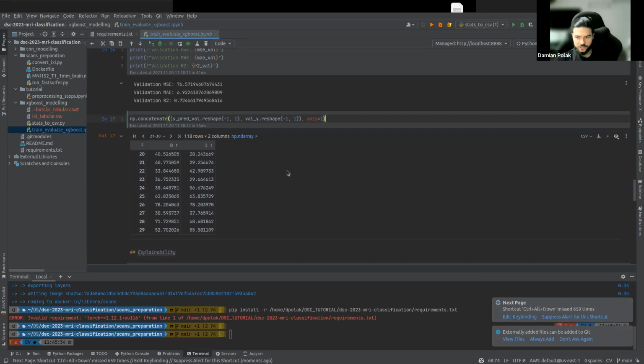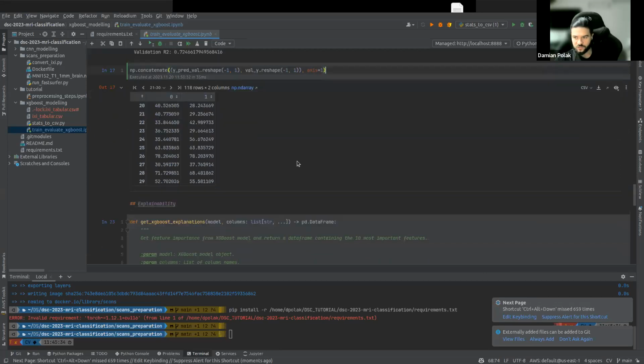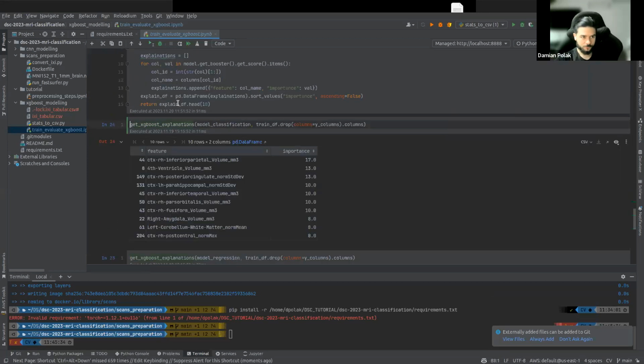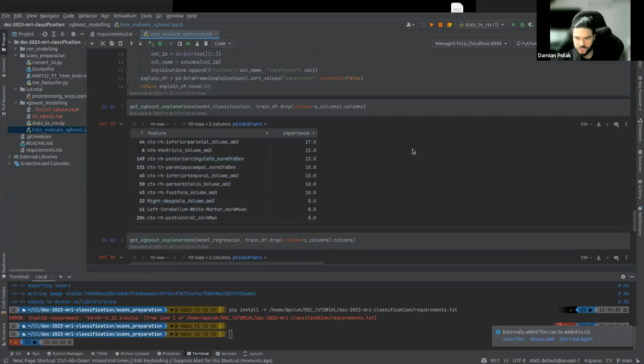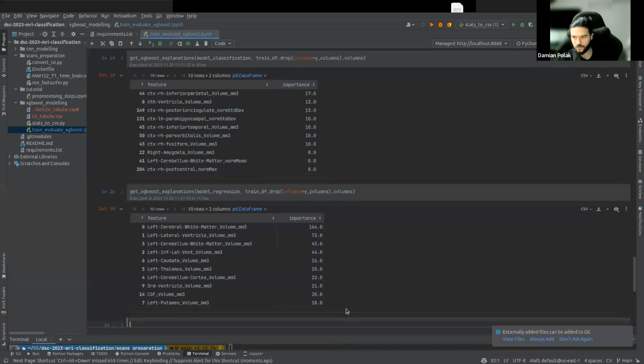And as an additional feature, I've included a basic explanation of XGBoost model explainability. In this section, we explore the feature importance of the given models. The presented tables highlight the names of the features and their respective importance values.